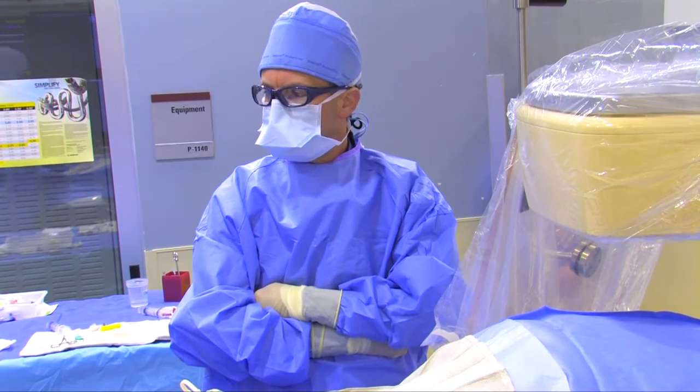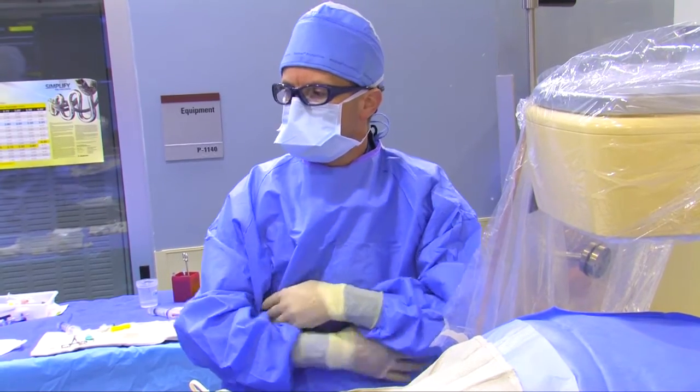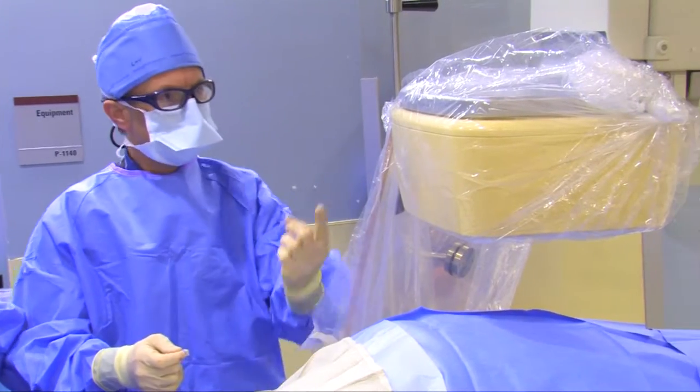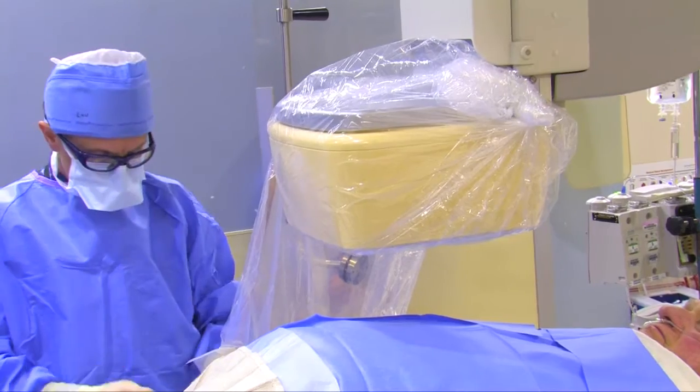Because we use x-ray, everyone's covered with lead. You can't see it under our gowns, but we all have lead on. This is an image intensifier — the x-ray comes from underneath, through the body, and is detected by the image intensifier.